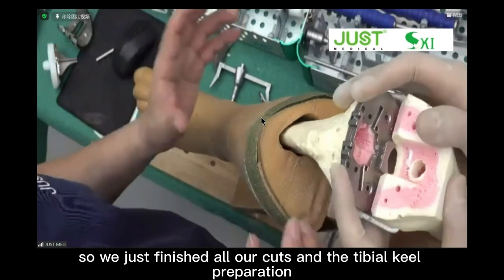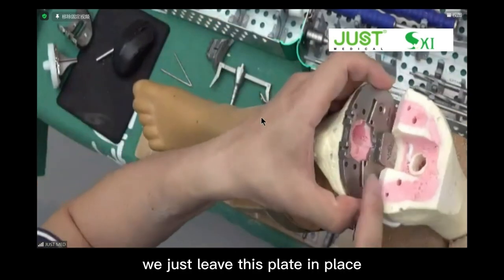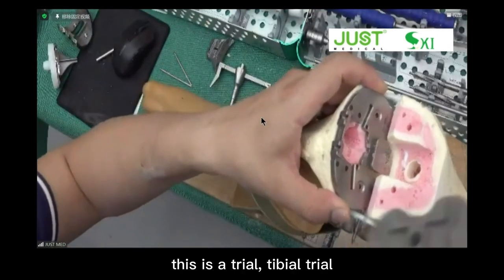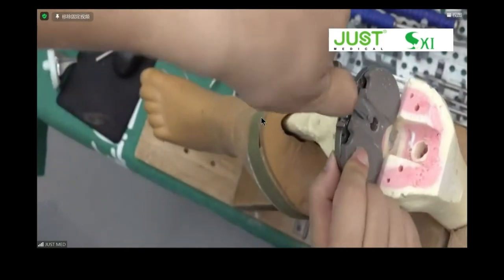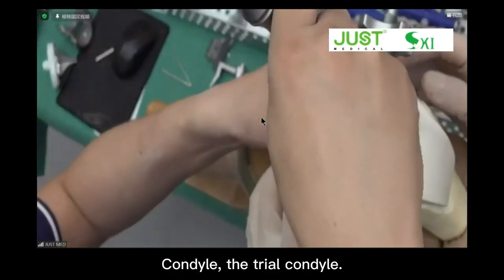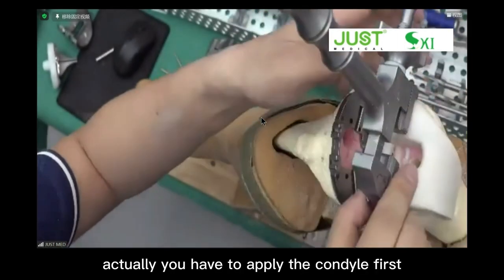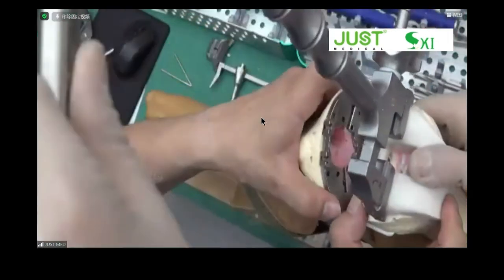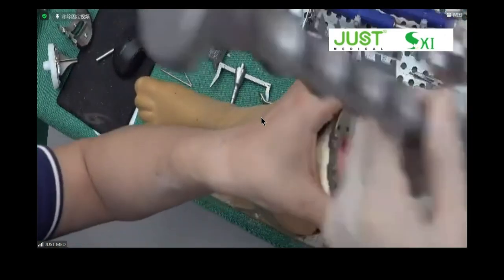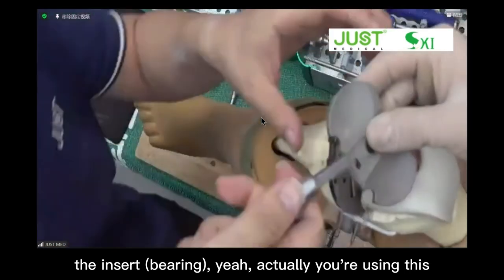So we just finished our cut and the tibial keel preparation. Now we just do the trial reduction. We leave this plate in place and choose a proper trial. Now, this is a tibial trial. To place the femoral trial, the short condyle, you select size five. And actually, you have to apply the condyle first. Okay.